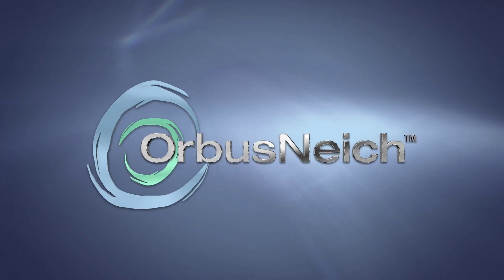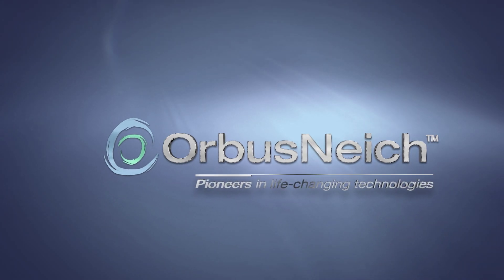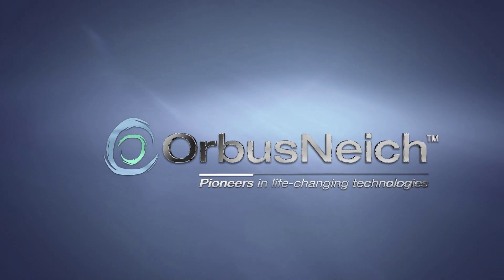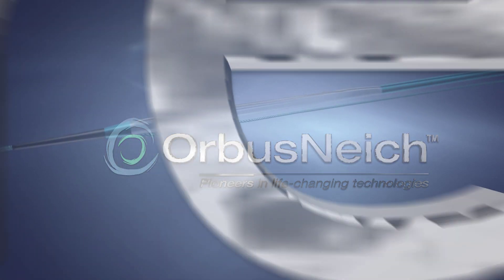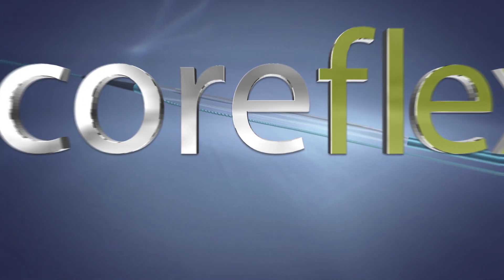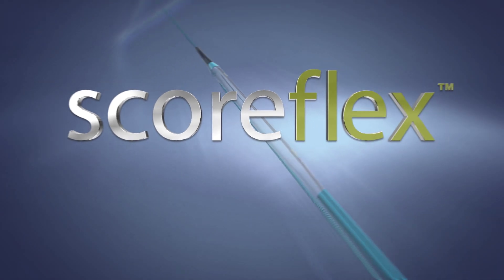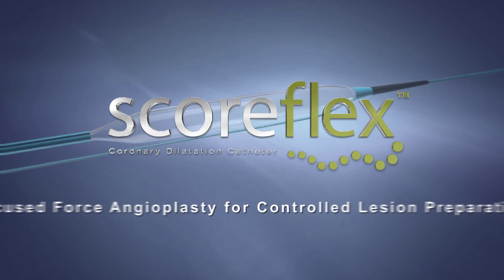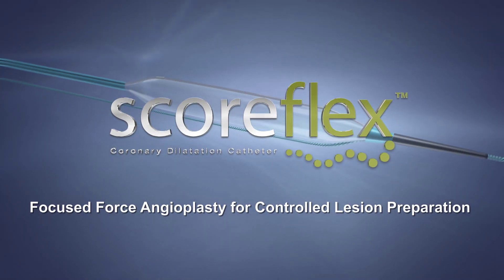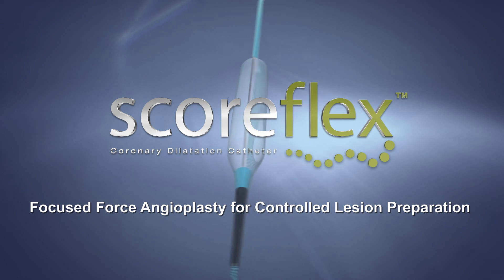Introducing the SCOREflex Dual Wire Balloon from OrbusNeich, a global pioneer in the provision of life-changing vascular solutions. SCOREflex is a focused force dilatation balloon that comes with a dual wire system that creates a focal stress pattern in a very localized area. This is the ideal balloon for controlled lesion preparation.